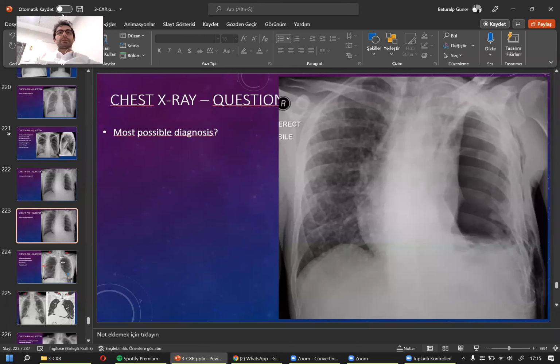So when it comes to the exam, it will be pretty much what I have been describing in the case of this lung X-ray, for example. It will consist of you making a technical evaluation, a systematic evaluation, and trying to come up with a differential diagnosis. Neither your exam nor your lectures were about memorizing lines and trying to find them in a multiple choice setup.